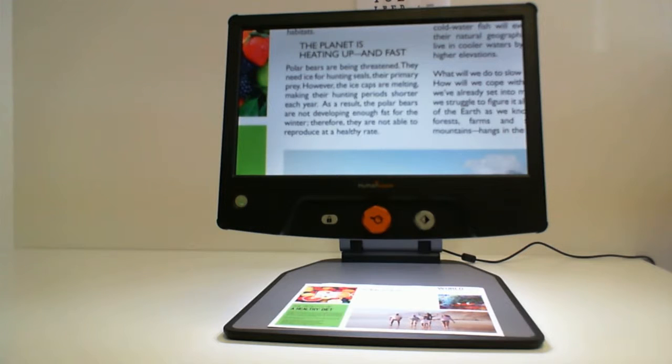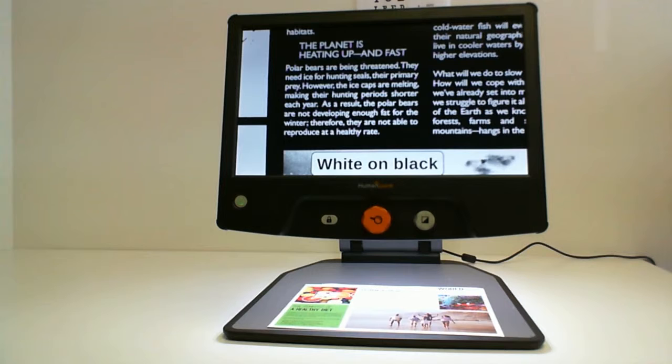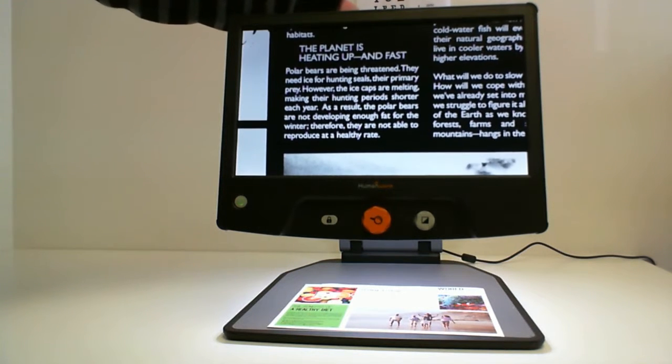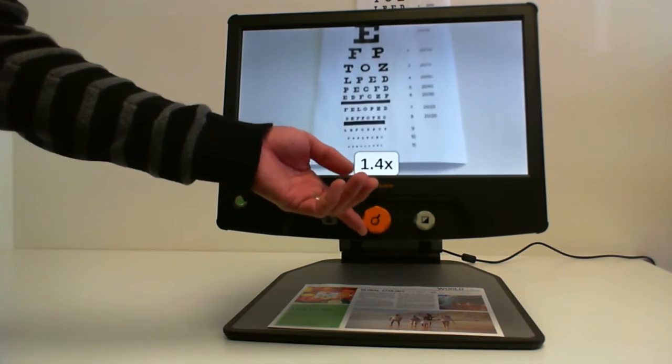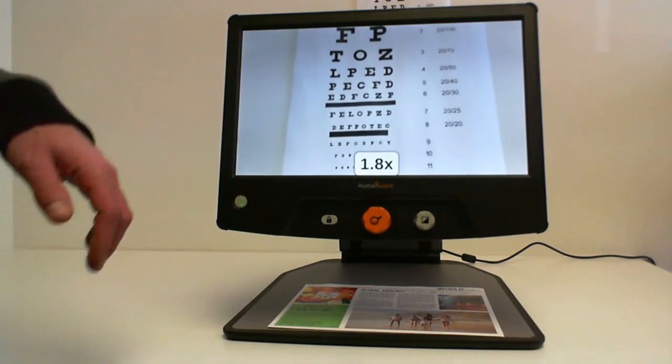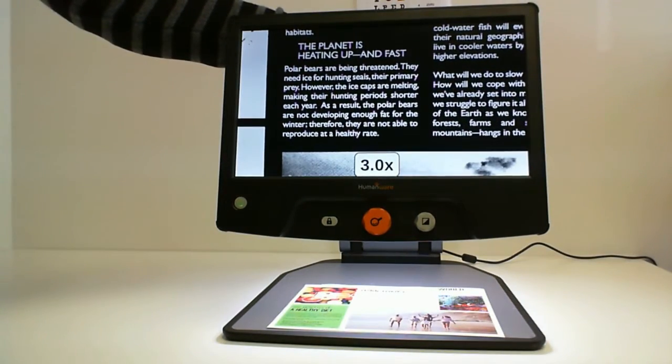In today's little video, I will be demonstrating the default values when toggling to distance viewing using your Reveal16. If you are using the Reveal16 in contrast color when reading a document and you decide to toggle to distance, the distance view will switch automatically to true colors and zoom back to 1x. So then you can use your distance camera either to zoom in or zoom out in your image. And then when you toggle back, your contrast settings will be kept for viewing your document.